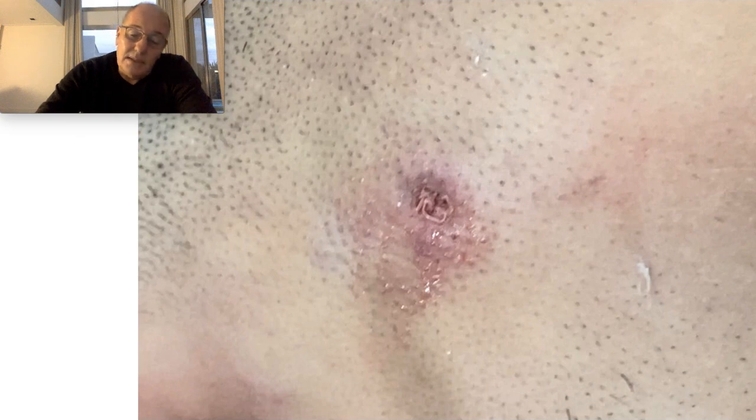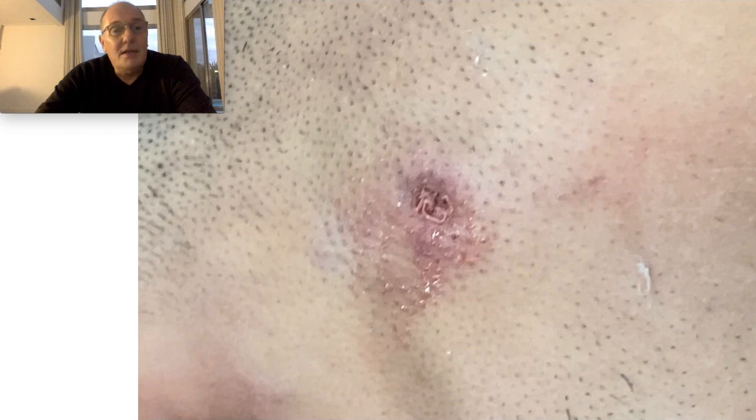This patient can go back to his town and we can keep in touch with photos. He only needs some cream, and in 10 days the hole is closed and no scar is left. I have hundreds of videos where you can see the kind of scar — or rather, the minimal mark — that this laser hole leaves. I hope you enjoy this presentation.